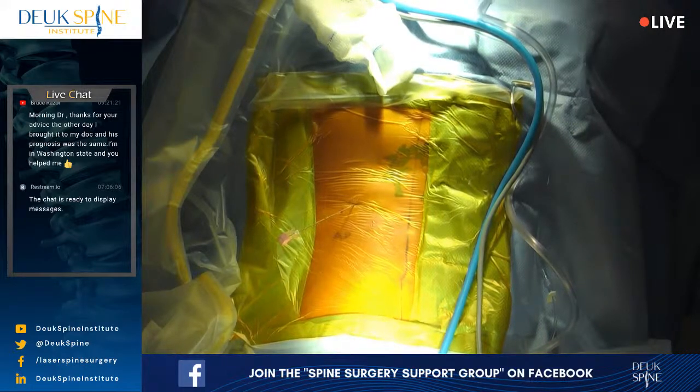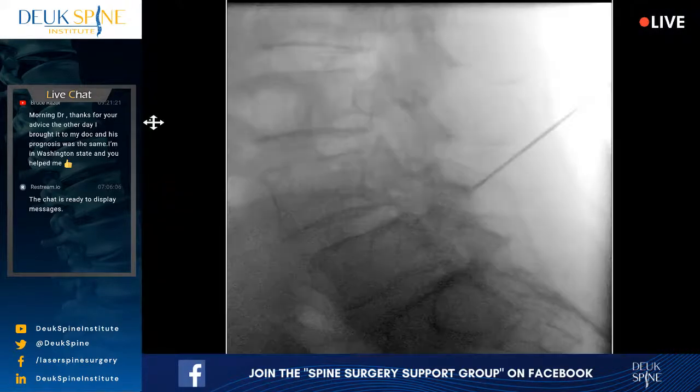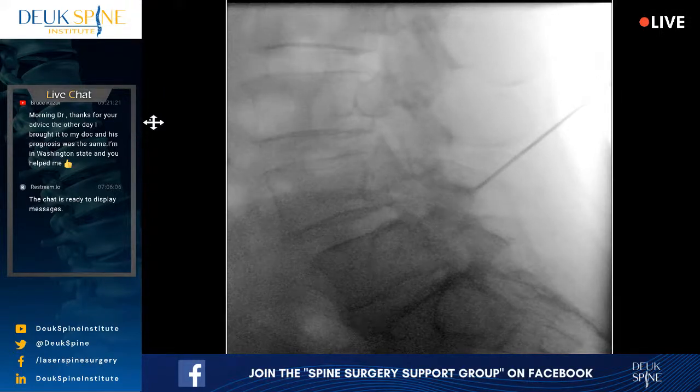So while we're playing with this just for another minute here, why am I taking so much time with lining the fluoroscopy unit up with the spine? I don't know, I think that's worse. The reason is simple. If you don't line things up properly, you will be way off from where you think you are. And you don't want to go somewhere you're not supposed to go with that needle. And what follows the needle are far worse instruments, bigger. So I have to get this right. So that's why we're taking our time.